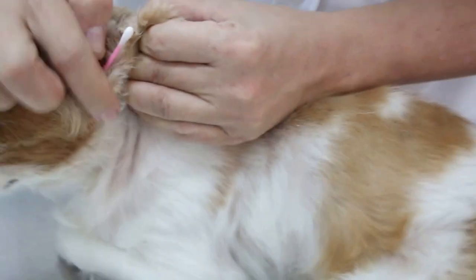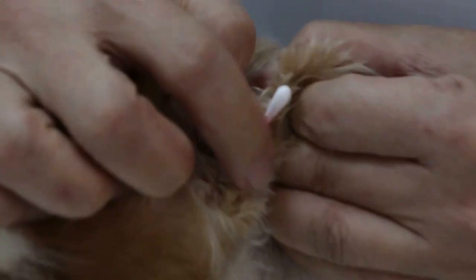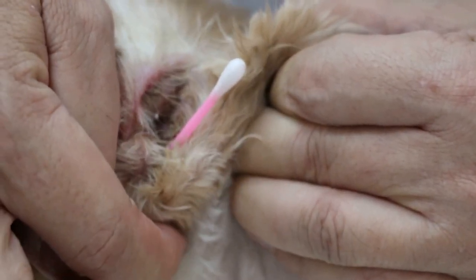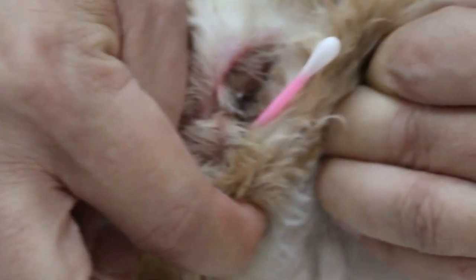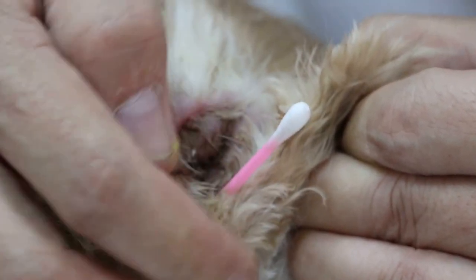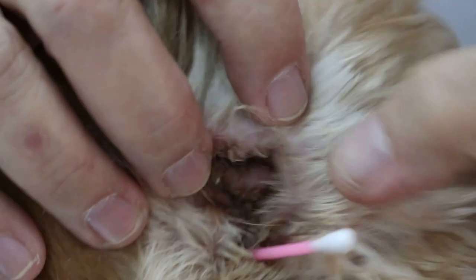So I can show you: this is the opening of the vertical canal. You can see it's very painful and very cheesy. This is the depth of the vertical canal. The surgery is to open up the side wall — cut off a rectangular piece — so that there is no more trapping of water and dirt.